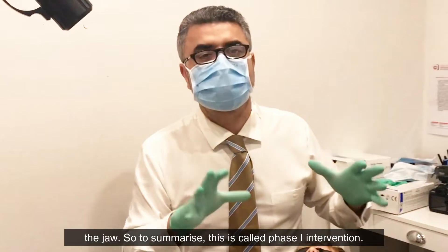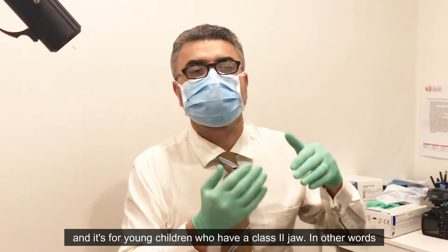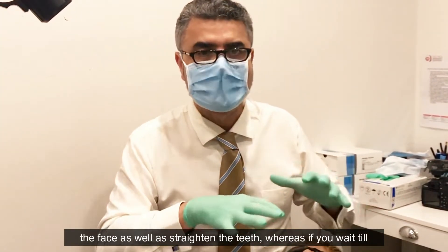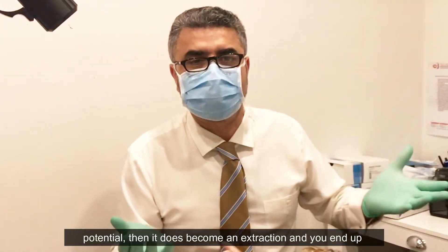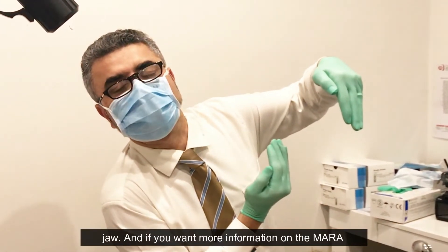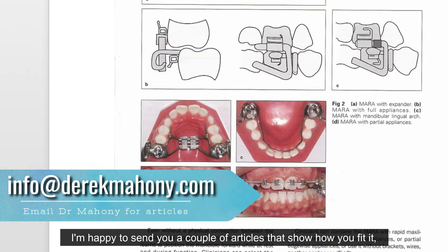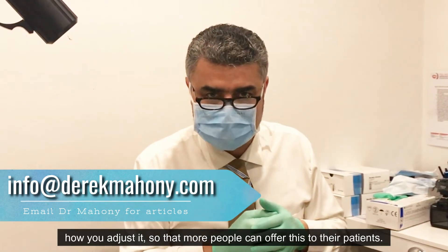To summarize: this is called Phase 1 intervention, and it's for young children who have a Class 2 jaw — in other words, a recessive lower jaw. By doing it early, you can balance the face as well as straighten the teeth. If you wait until the child has all their adult teeth and the lower jaw has no growth potential, it becomes an extraction case, and you end up having to pull back what is actually a lower jaw problem. If you'd like more information on the MARA, I'm happy to send you a couple of articles showing how to fit and adjust it, so more people can offer this to their patients.